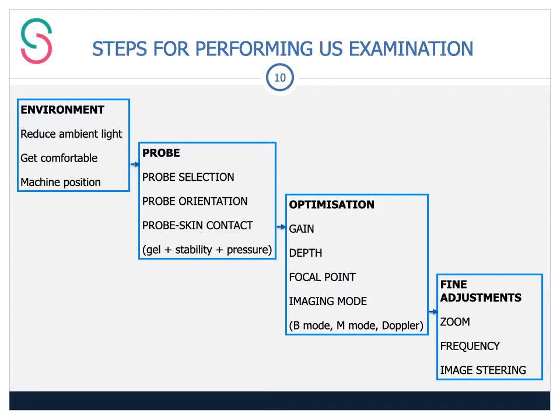The second aspect is choosing the most appropriate probe for the task in hand, then checking the probe orientation and ensuring that there's plenty of gel on the probe so that you've got good probe to skin contact.